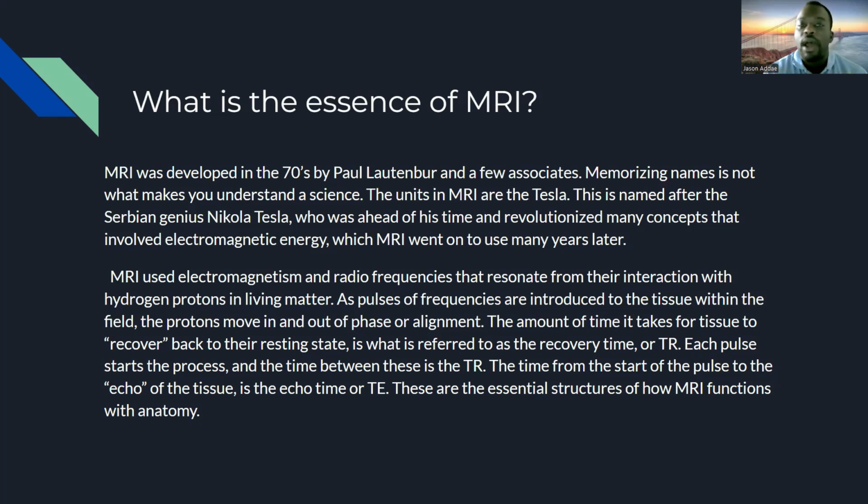And it's the same way in MRI. The echo time is shorter for denser matter, or what we would call T1 imaging, T1 relaxation. T2 is more fluid matter, such as blood, CSF, or pathology, that's going to be like water.